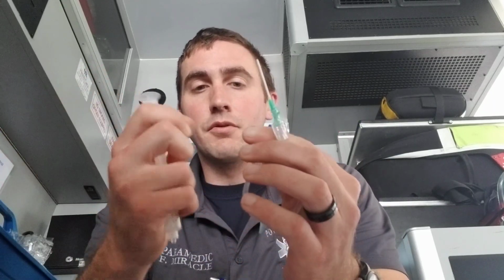But what we often forget about is that once we disconnect this, we still have medication sitting in here, and we tend to just take a flush and push that in. So you also want to push that into the patient slowly with a flush until you get to at least, I would say for safe measure, 2 mLs.